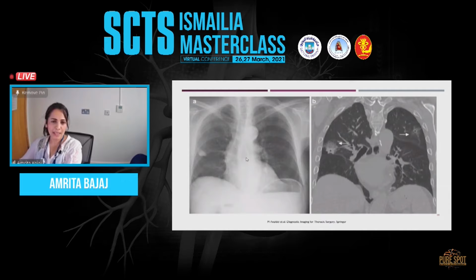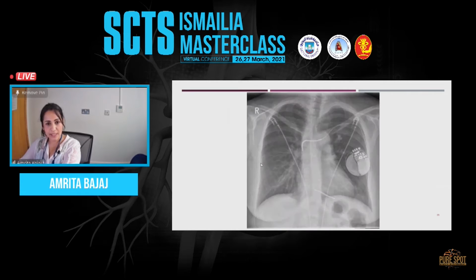Now that shows the limitation of chest x-ray. You can see this kind of nodule in the right mid zone, but when you see it on the reconstructed MIP images, you find there is a much larger subsolid nodule and a nodule even on the opposite side, which is not so well demonstrated on the chest x-ray.